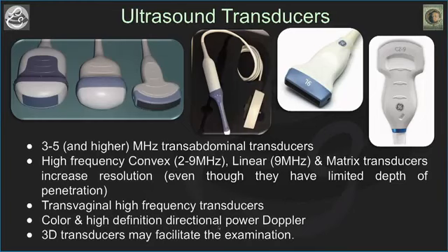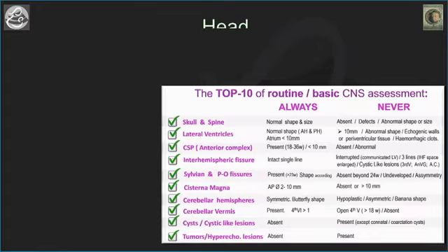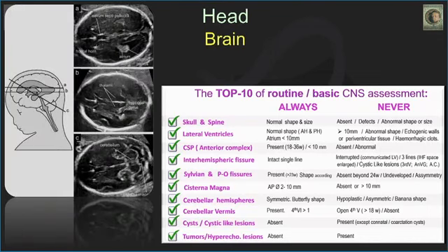So this is how we shift over to that. In the next 5 minutes, I will tell you that yes, you do need to use a lot of transducers, and the transducer, which is transvaginal, is certainly the best. The next thing that you need to know is that the checklist that you need to use is always this, and it must be covered.